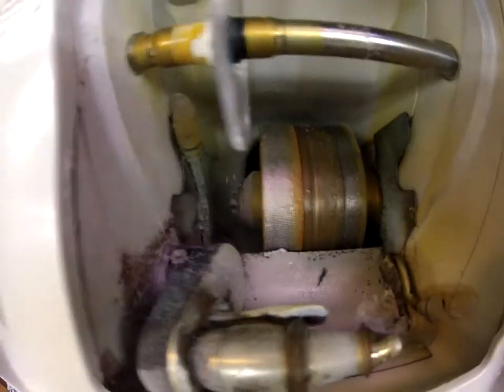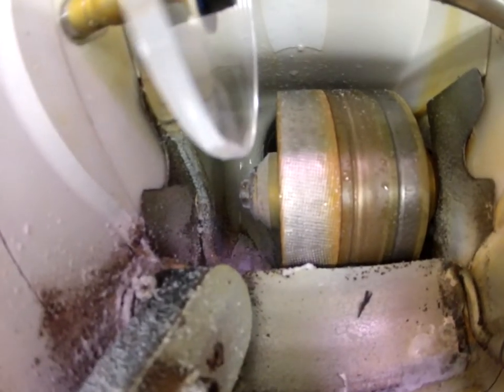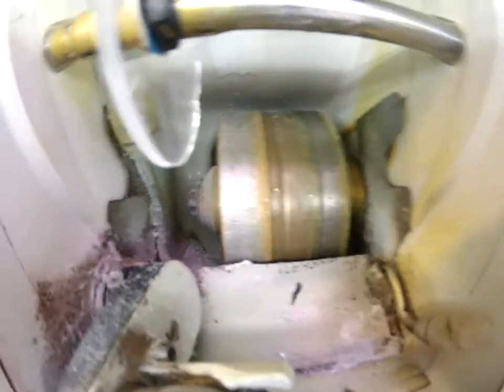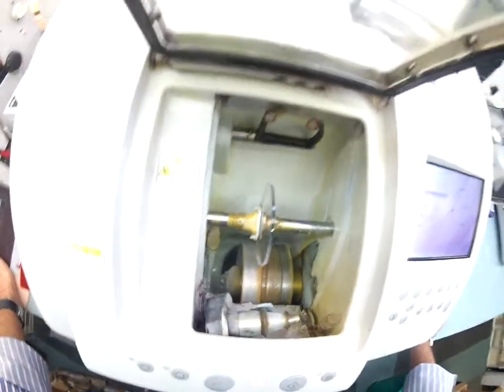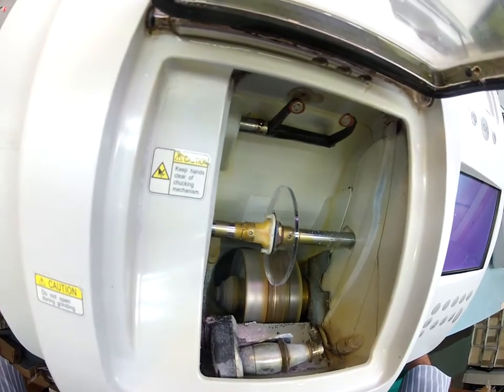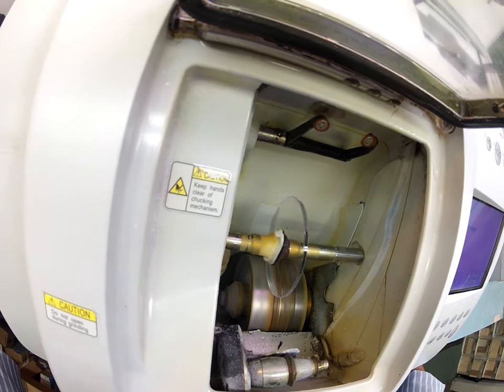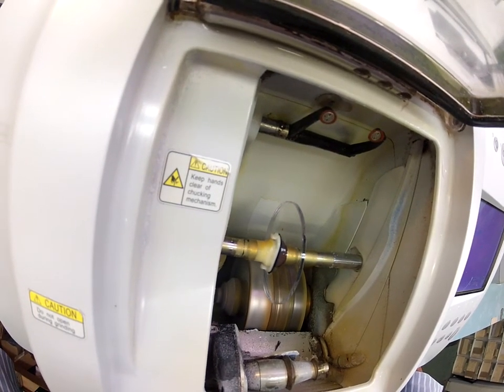The actual cutting wheel is down here on the bottom on the left. It is like a heavy grit sandpaper, that lighter color wheel. This wheel in the center with that channel is what's going to put the bevel onto the lens so it stays inside the bevel of the frame. I will have to close the door as your polycarbonate prescription lenses touches down on the cutting wheel. But until then, I just want you to see that, then I'll close the door.